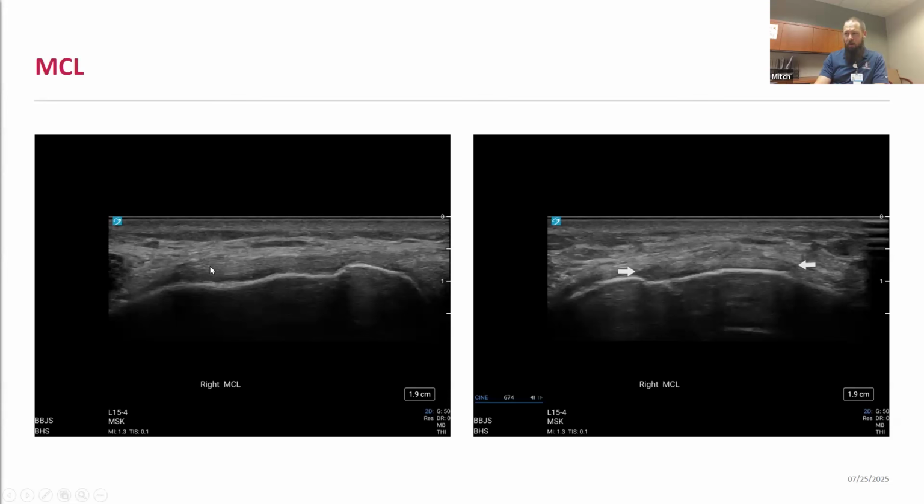Specifically, if there's been any prior history to the knee or persistent pain at the proximal MCL, you may also be looking for any proximal calcification that can be indicative of a previous MCL trauma. We refer to those calcifications as Pellegrini-Stieda lesions. And so that's something to evaluate for in these long and short axis views at the proximal MCL.